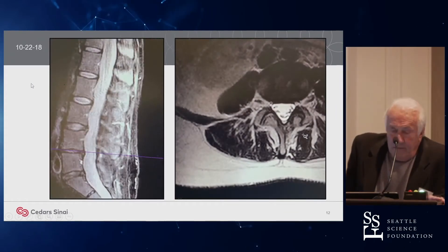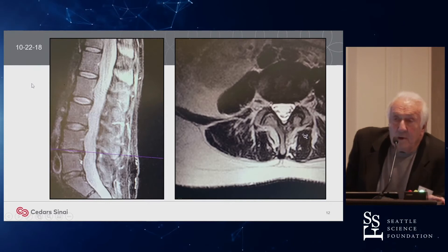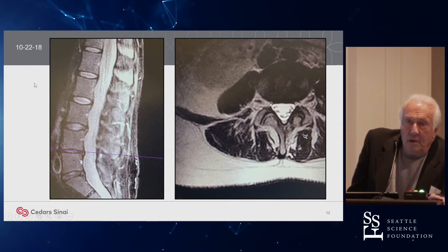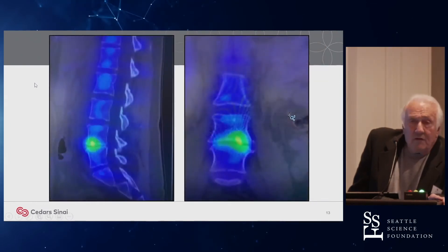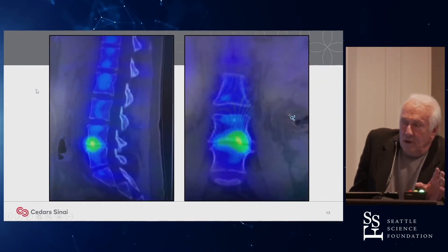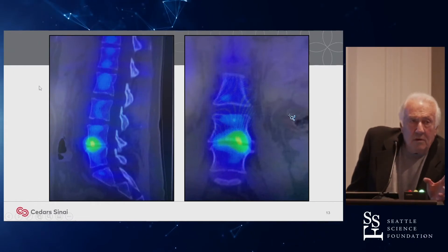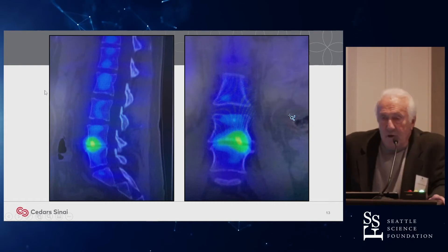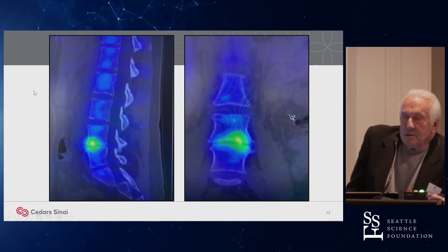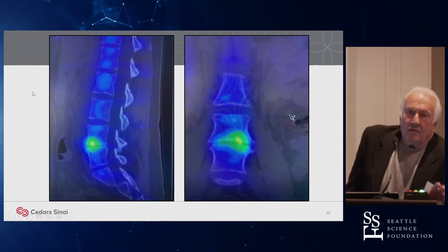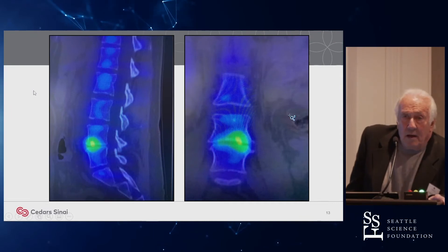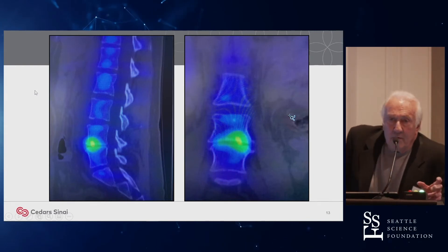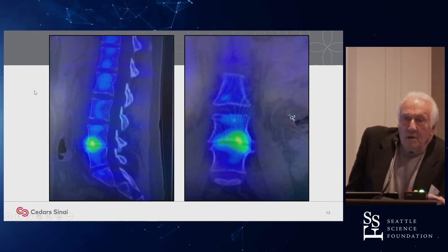Her MRI from October 2018 shows a narrowing at L4-5 and some degenerative changes at L5-1. On the SPECT scan in this particular case, it's really clean everywhere else, but here you've got intradiscal inflammation. Nobody knows exactly what that means — it's a controversial subject. When we discussed it, I sent her for an anesthetic discogram, which was basically negative: they injected the disc with bupivacaine and her pain did not get better. I advised her not to have an operation. In many hands, this woman would have had a disc replacement or a fusion.